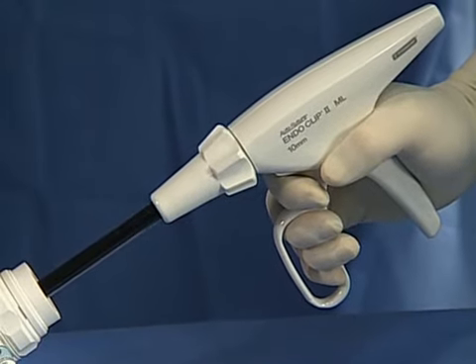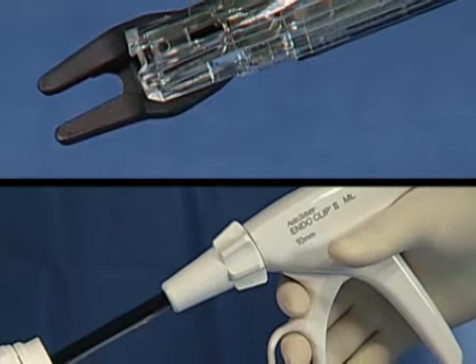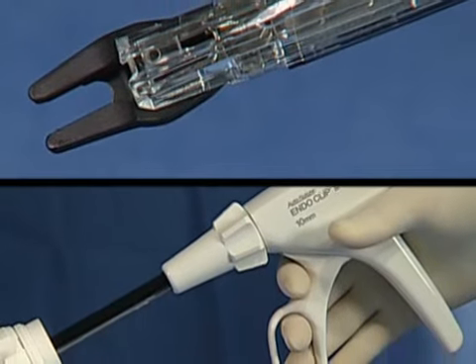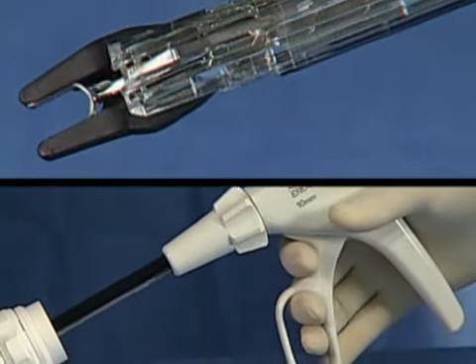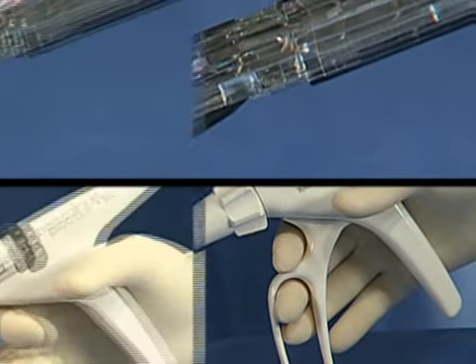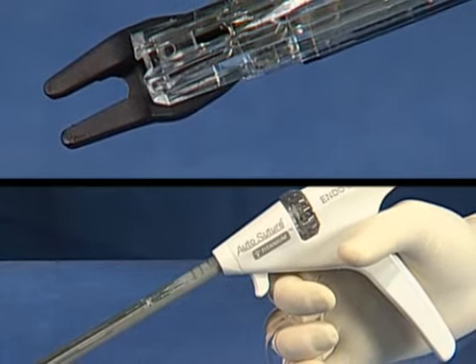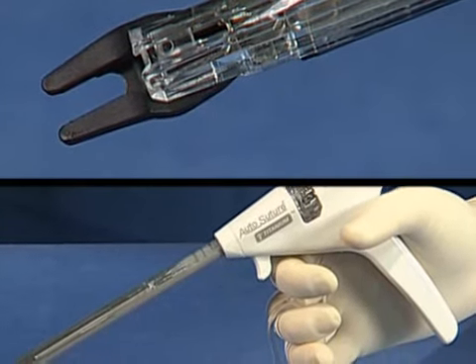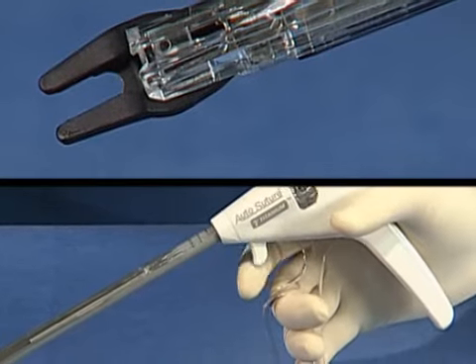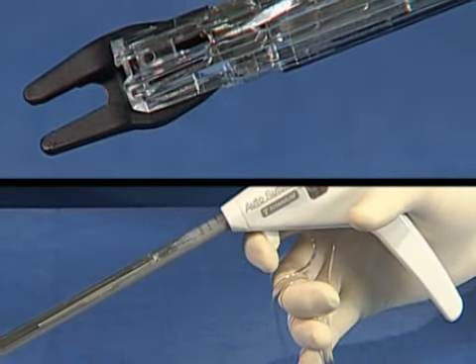1. On the EndoClip 2, the clip loading and closing is controlled by the looped handle. Load by gently squeezing the handle until an audible click is heard, feeding the clip into the jaw. 2. The EndoClip is loaded by squeezing the small trigger mechanism attached to the underside of the device handle. Again, an audible click will be heard to confirm loading of the clip.